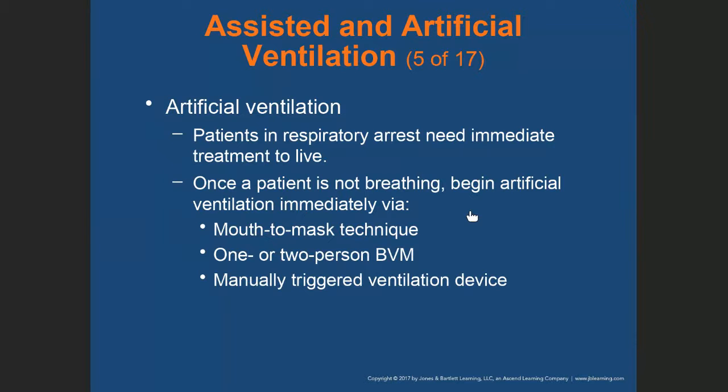And all of you will be required to be present for your skill station with a pocket mask. So when we start our face-to-face, do not turn up without a pocket mask. There is a skill sheet for that, and you must be examined with a pocket mask. So start investing in one. You're going to need it for your skill station.